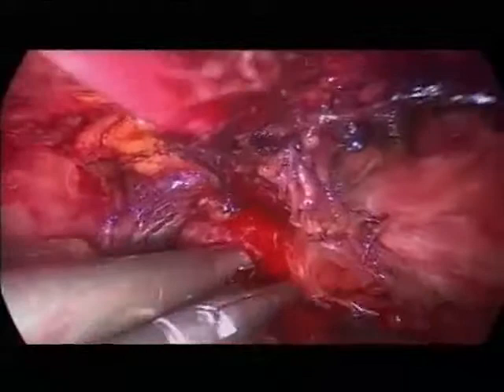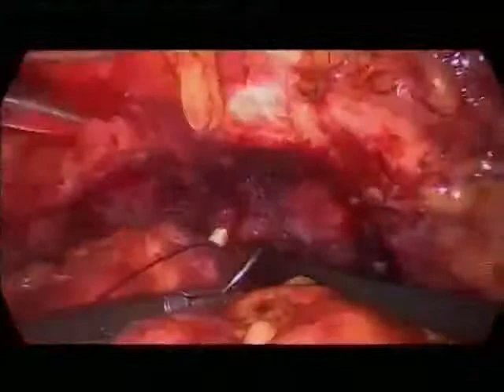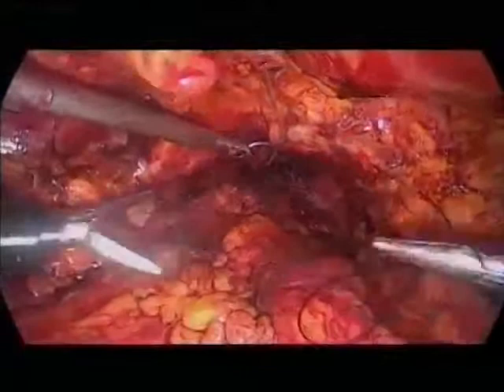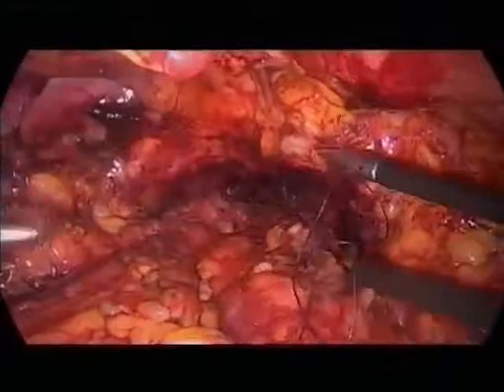And if it's bleeding, I will put a clip, but... And now you can push. You see, I'm going to see if we have cut the last pedicle. I think, you know, I need a clip here, and then I will push. Yeah. We need... No. Here.